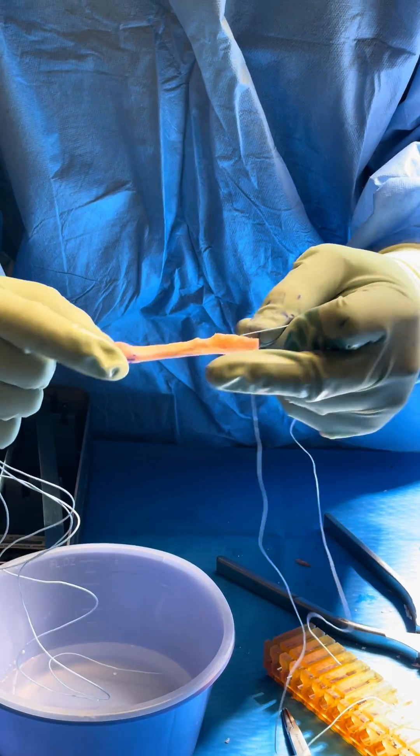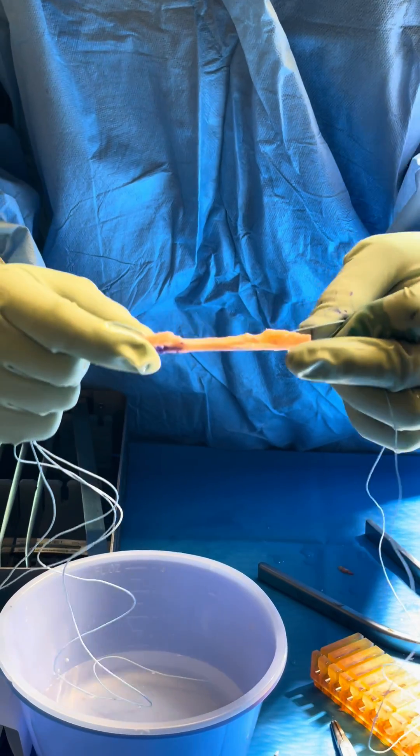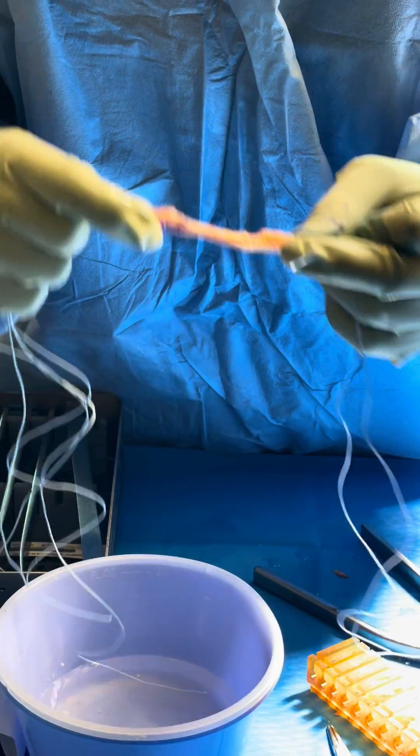So we've got the central third of the patient's patella tendon with bone on each side, and that's going to be used to reconstruct their anterior cruciate ligament.